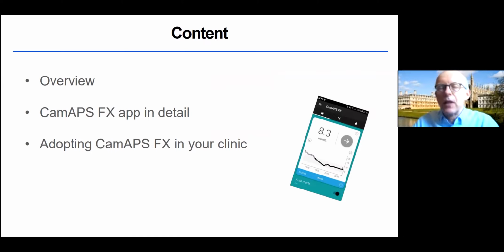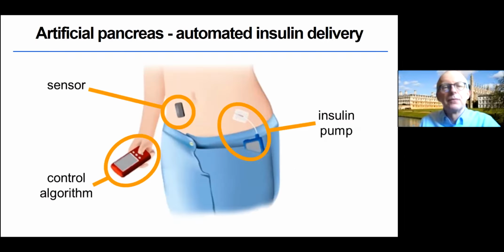So what we'd like to do today is to overview the CAM-APS-FX app, and provide clinical evidence, provide information about some of these features, especially about the personalization features which are unique to this app, and also spend some time on what are the steps of adopting the CAM-APS-FX in your clinic, should you wish to do so.